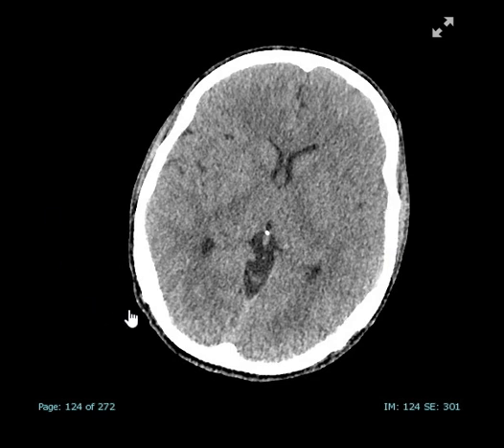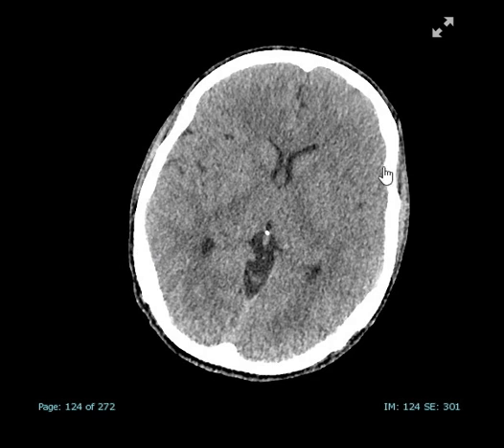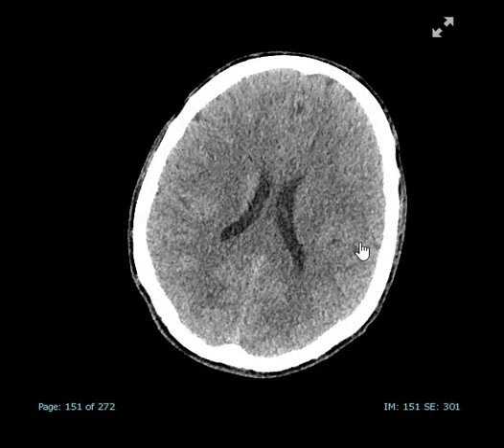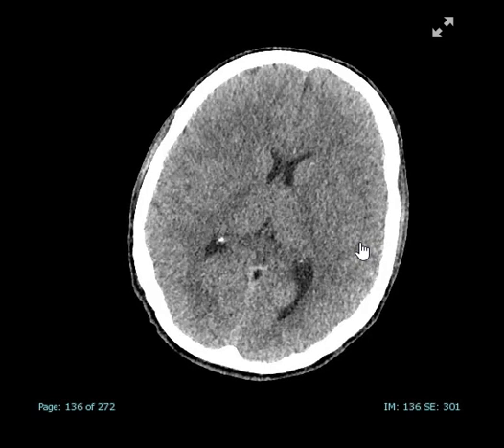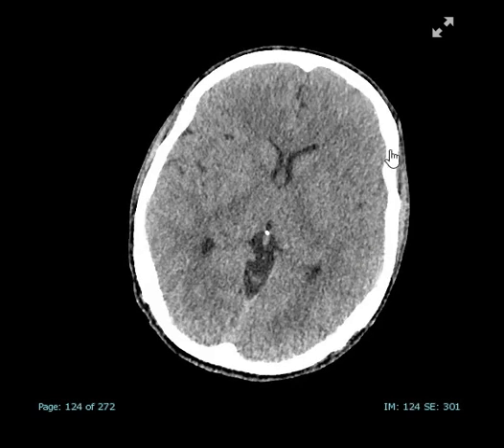The abnormality is staring at you. You can see the sulcation on this side, but you can't see them very well on this side — the left side. What that means is there's a lot of swelling going on in the left side.